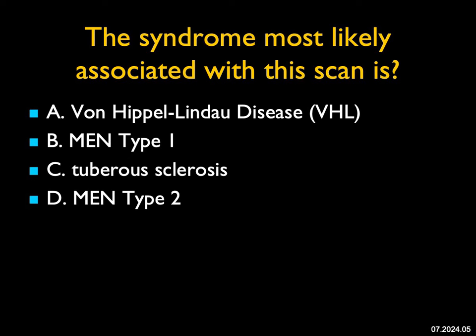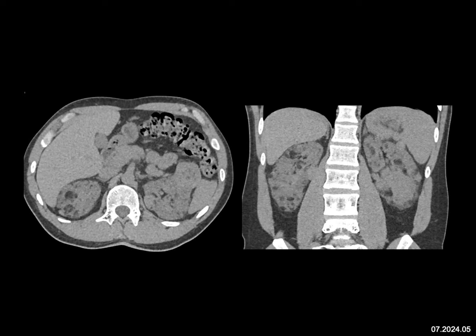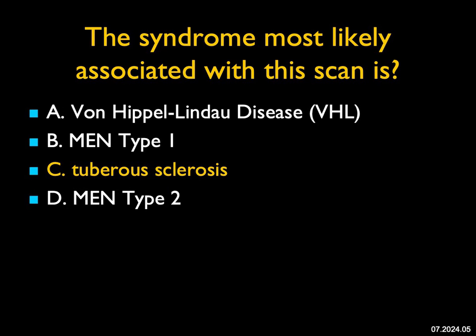The syndrome most likely associated with this scan: I see multiple renal masses, and if you look carefully, they have fat density. There are multiple angiomyolipomas of the kidney. That doesn't occur with MEN1 or MEN2. It doesn't occur with von Hippel-Lindau disease, where you see cysts in the kidney as well as renal cell carcinomas, but not angiomyolipomas. Multiple angiomyolipomas are typically associated with tuberous sclerosis. You'll often see changes in the lung as well, but tuberous sclerosis is the correct answer.